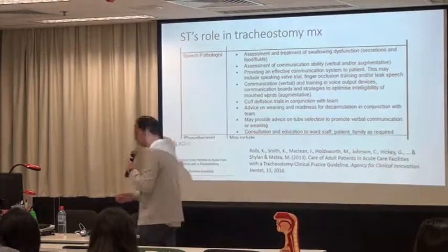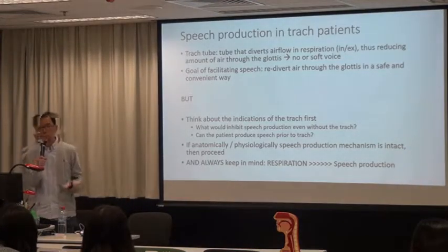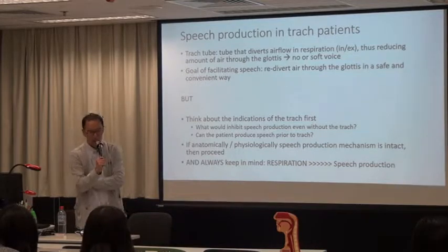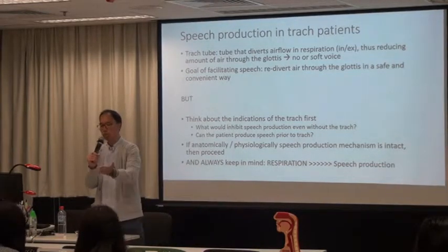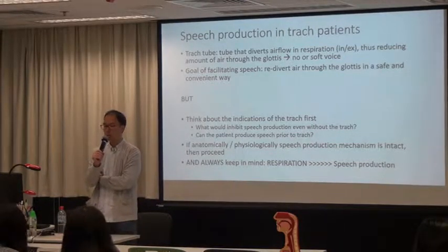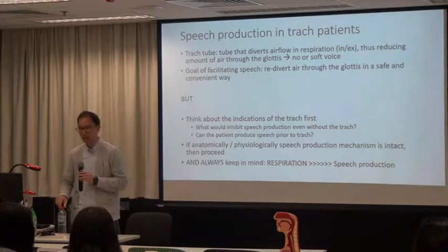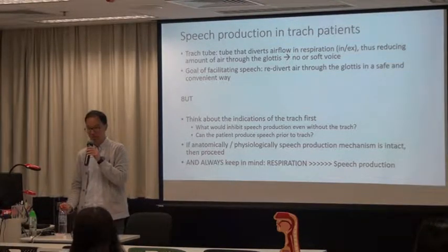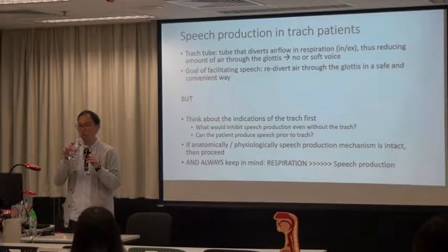So that's our role. Now, how do we actually get speech produced? To the students who have seen a patient on a tracheostomy tube, can they talk? Were they able to talk? Yes. How were they able to talk? Just pressing the bar.